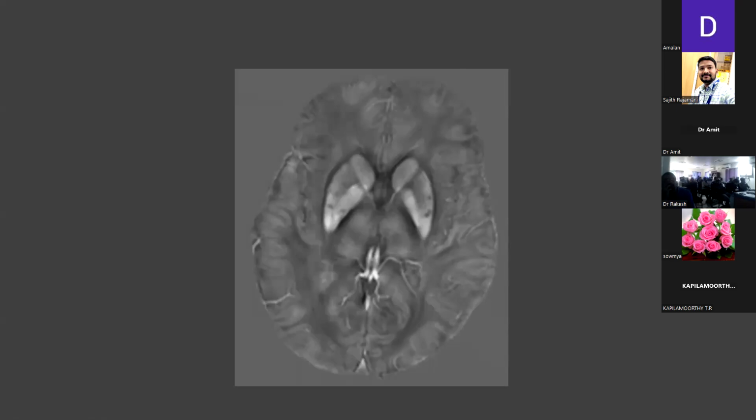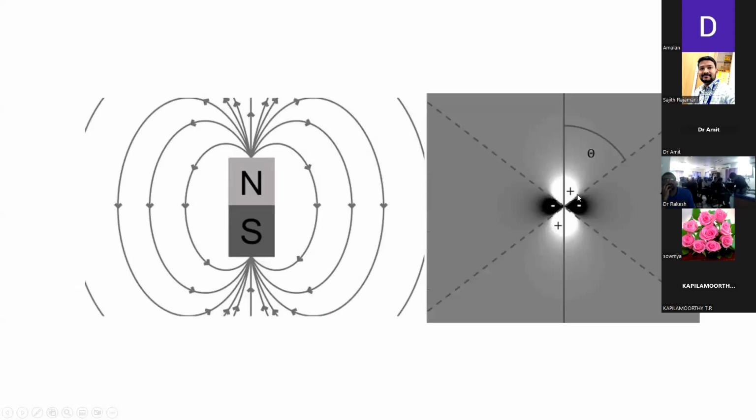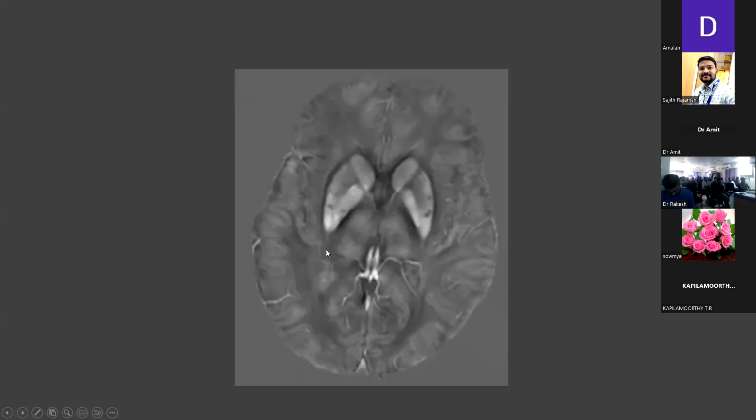One method is to use truncated K-space division, TKD, which does some processing to remove those zeros. Also, we can do multiple angulations, so that if we angulate, the zero becomes a non-zero value, we'll get some values, right? So we'll estimate that value and do the dipole inversion. But that is not a practical scenario. We would need to ask the patient or a volunteer to tilt their head and acquire data. That is very impractical. So the truncated K-space division, TKD kind of approach is preferred.